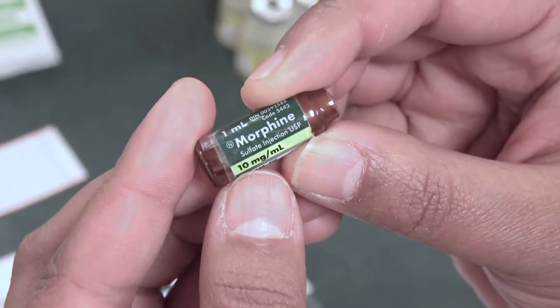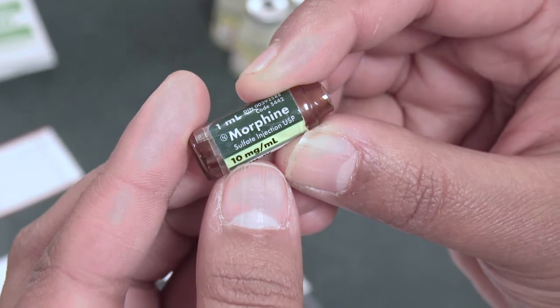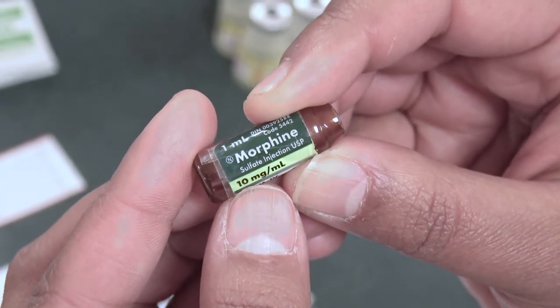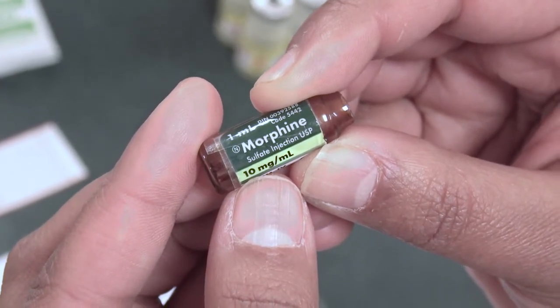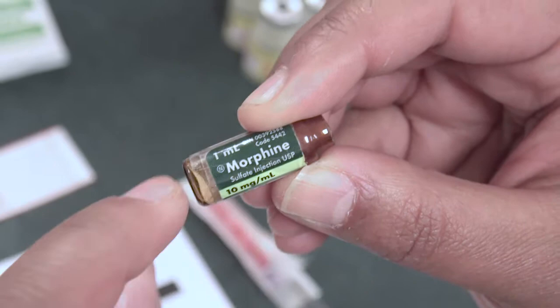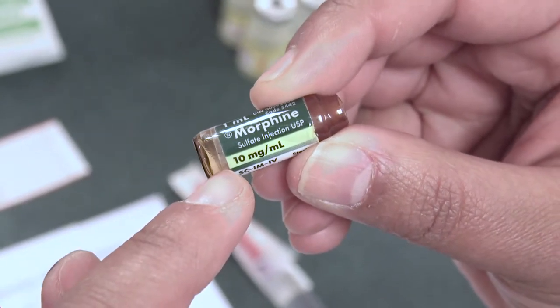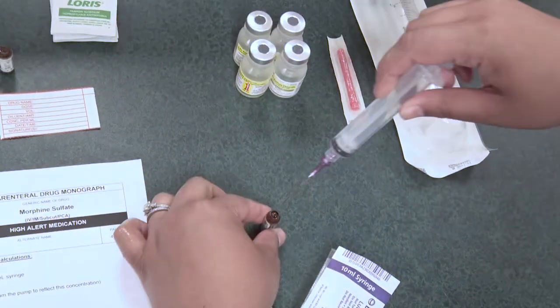When you're pulling it out from Pyxis, make sure it's the right concentration. This is 10 milligrams per milliliter, and that's what the monograph said: 5 ampules of 10 milligrams per milliliter. This is only 1 milliliter of morphine, but it's 10 milligrams in that 1 milliliter.